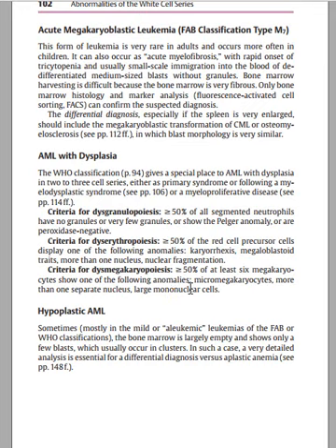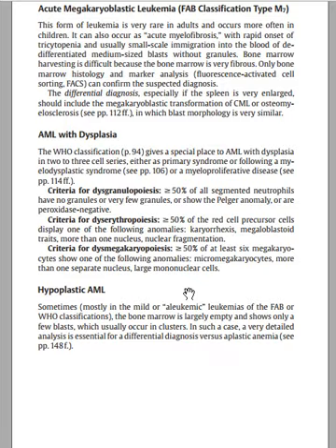You can see large mononuclear forms, because normally what is involved in the breaking down of the megakaryocytes into platelets are the structures attached at the level of the megakaryocytes. But if you see large mononuclear cells attached to the megakaryocytes, you can know that this is a dysplasia involving the megakaryocytic pathway. Is it clear?